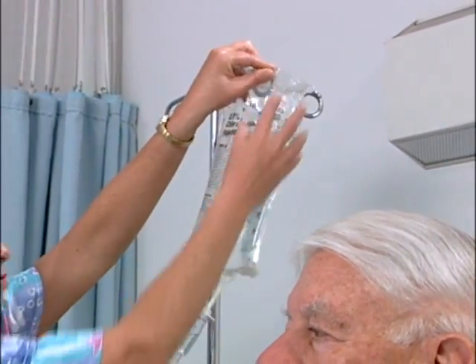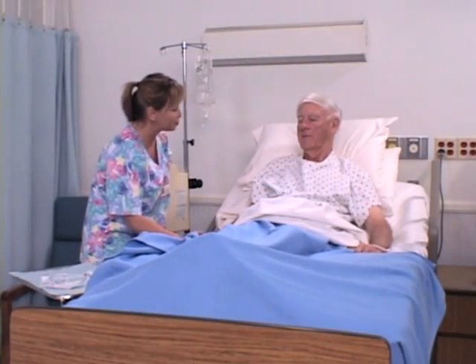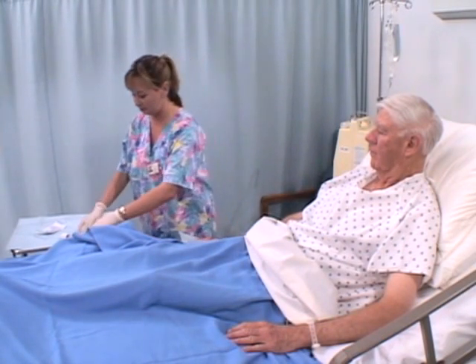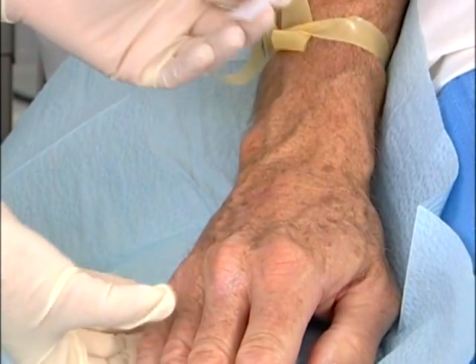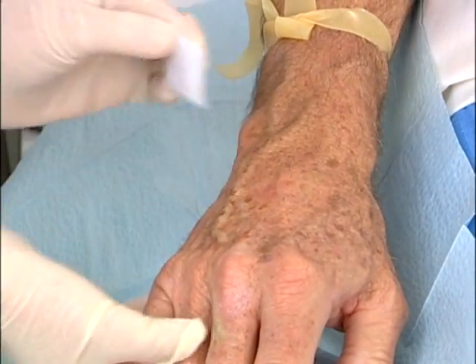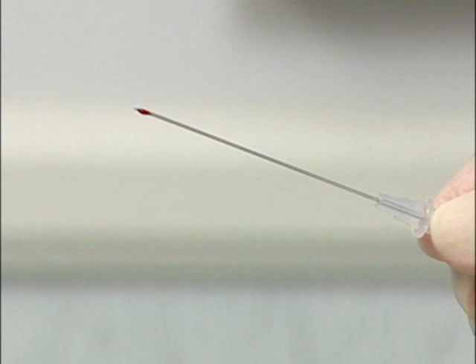Over 90 percent of all hospital patients receive intravenous fluids administered through an IV, and performing a safe and successful venipuncture is the heart of intravenous therapy. As recently as 2004, the Centers for Disease Control, or CDC, estimated that up to 800,000 contaminated percutaneous injuries occur annually to health care workers in both hospitals and other health care settings. Of these injuries, the greatest risk of seroconversion to blood-borne infections such as HIV and hepatitis B and C viruses is from blood-filled hollow-bore devices like IV catheter introducer needles.